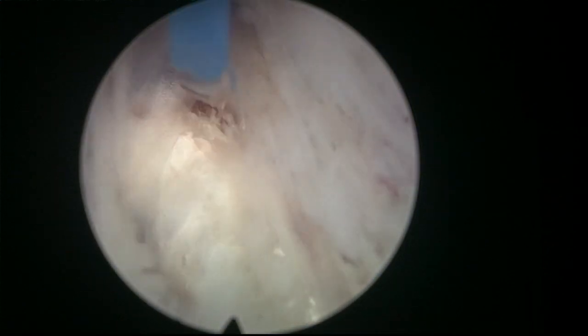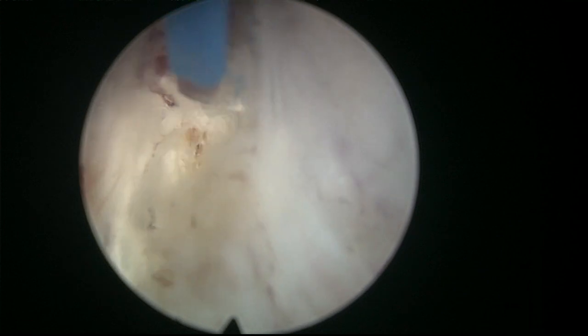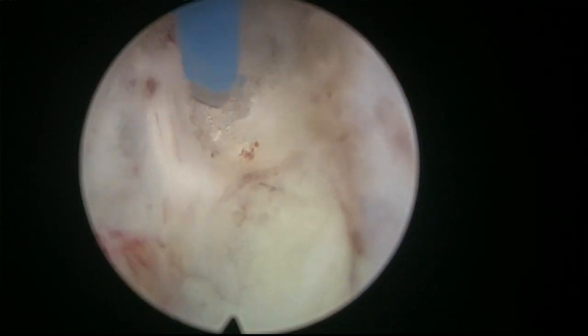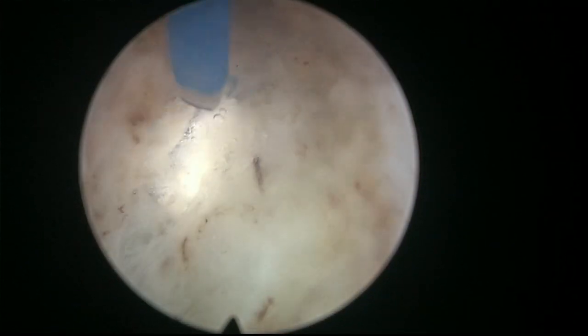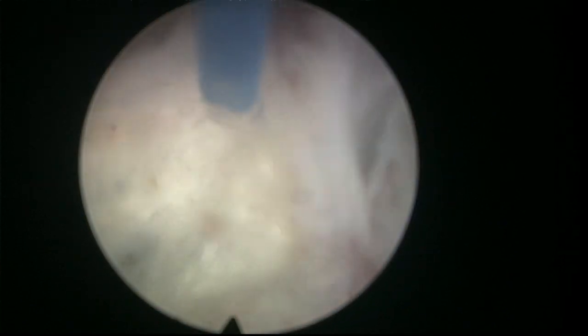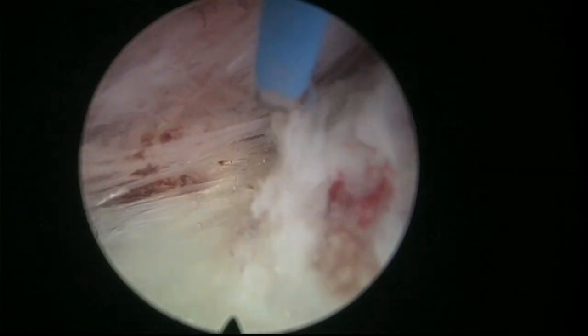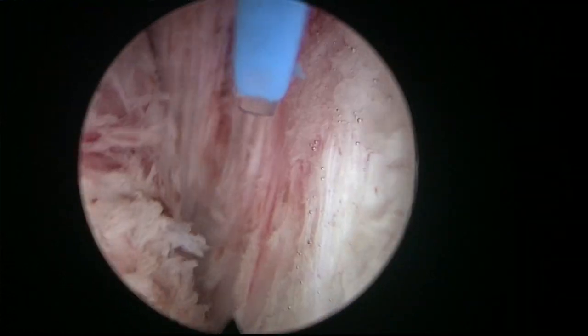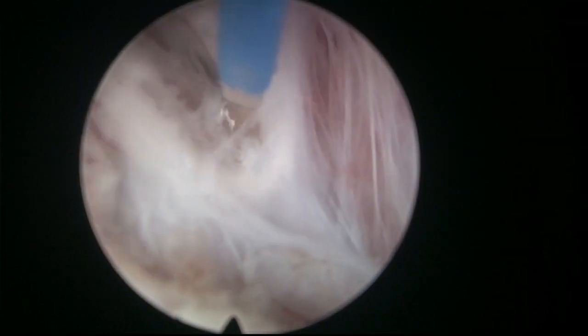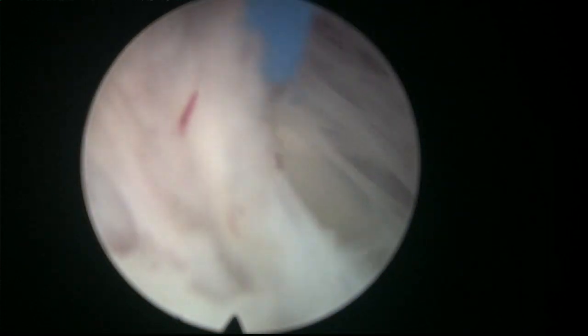Of course, as we pass the equator of the dissection, the fiber has to point a little bit closer to the adenoma, not right at the line of attack as we were doing at the beginning. This is because of the pseudo spherical nature of the adenoma. Initially the plane was going up, and now the plane has to go down here. Initially it was going outside, and now it has to go inside, to the midline. So instead of firing right at the line of attack, which could take me into the capsule, you have to get progressively closer to the adenoma.